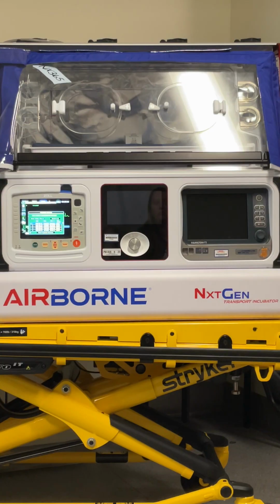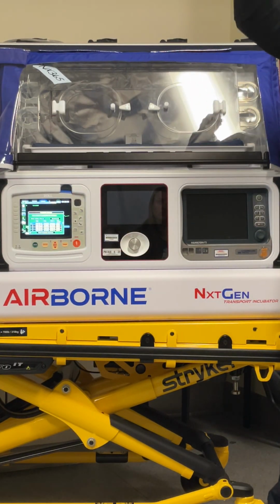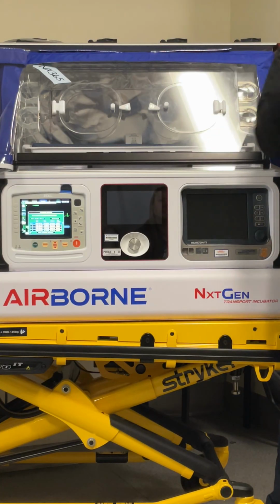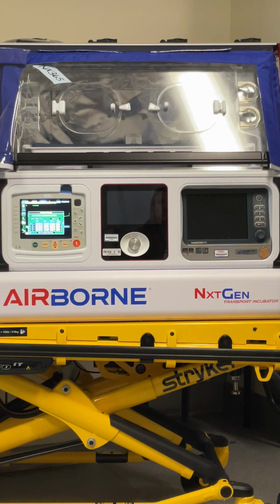Actually, here it says 150, but if you're running a 4-hour call, that's not gonna be 150 4-hour calls. A call is roughly a 30-minute time frame with data being collected. So I can do an 8-hour trip from Appleton, Wisconsin to Rochester, Minnesota, one way is 8 hours, and I don't run out of space on my monitor. Is there a way to clear it though? You don't need to. It's got FIFO memory, first in, first out. So it'll overwrite the older stuff as the new stuff comes in. You actually can't delete it.